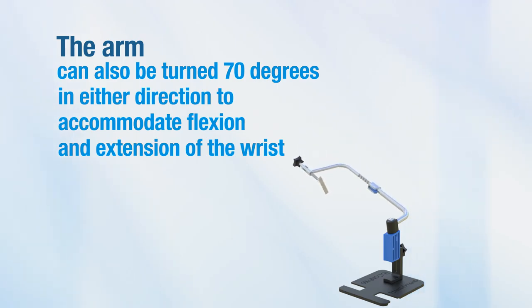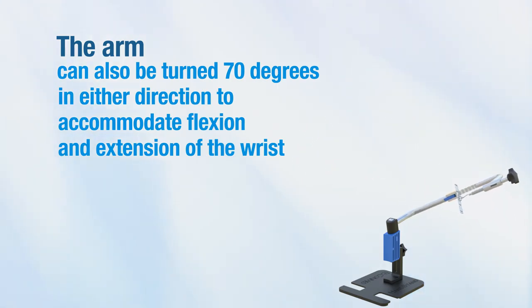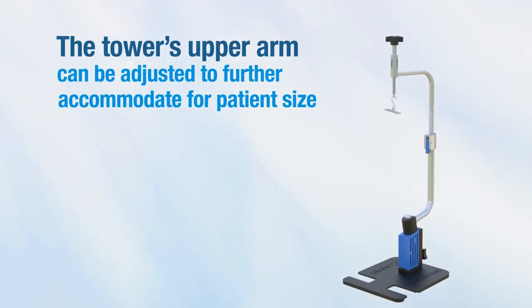The arm can also be turned 70 degrees in either direction to accommodate flexion and extension of the wrist. The tower's upper arm can be adjusted to further accommodate for patient size.